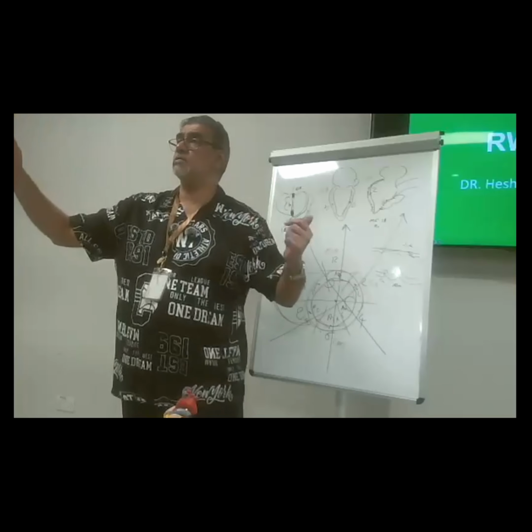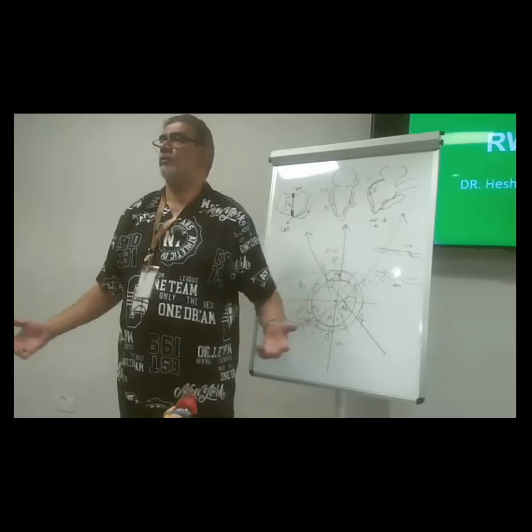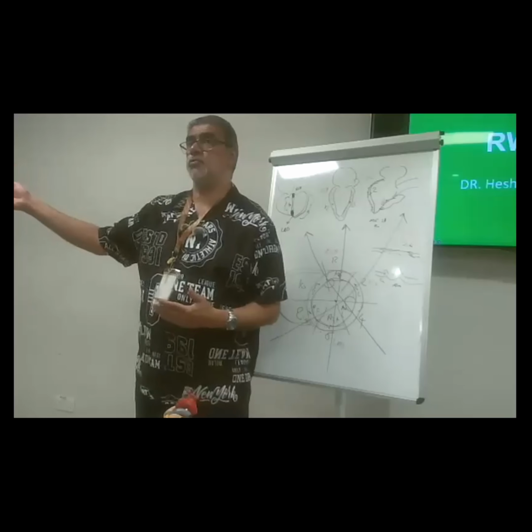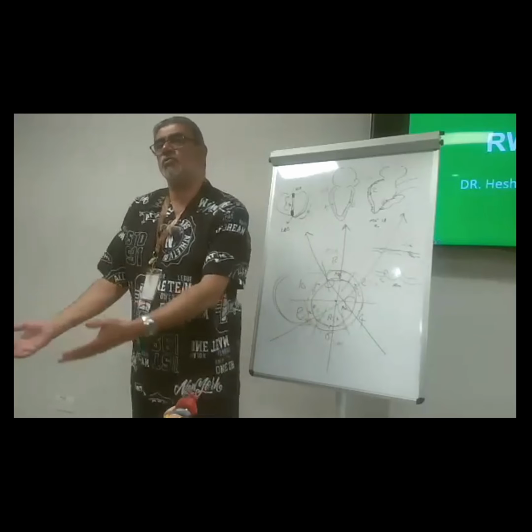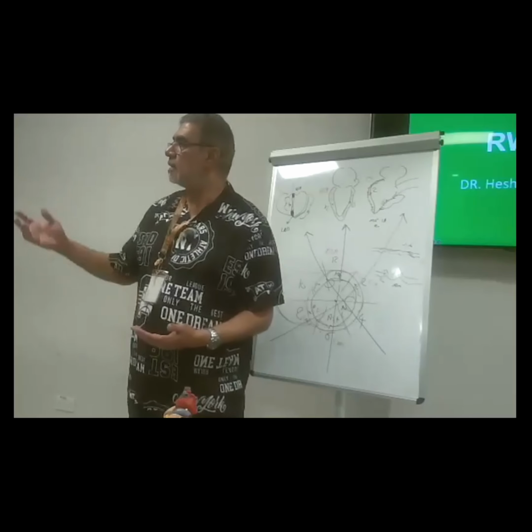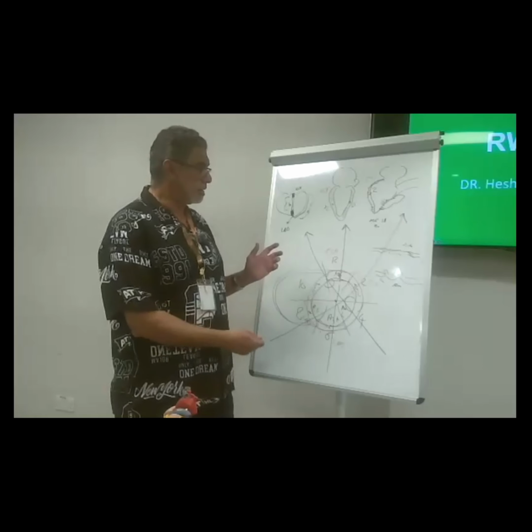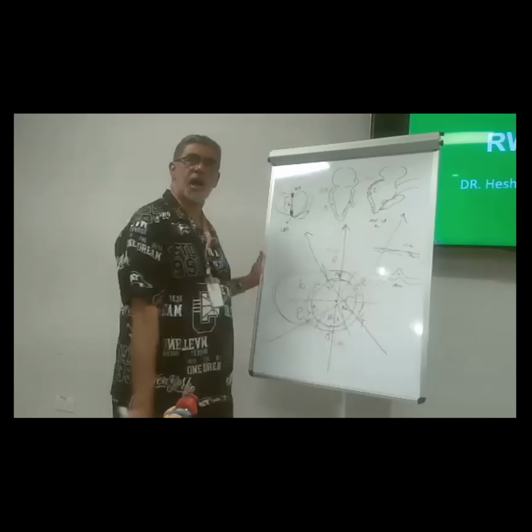It was a case of mitral valve replacement. Patient came off bypass. Hemodynamics are borderline. I start to increase the inotropes. I ask to check with the volume. Is the patient responding to volume or not? It's not responding. Still hemodynamics are borderline. I escalate the inotropes. Still borderline. I look at the TEE and I found this area is hypokinetic.